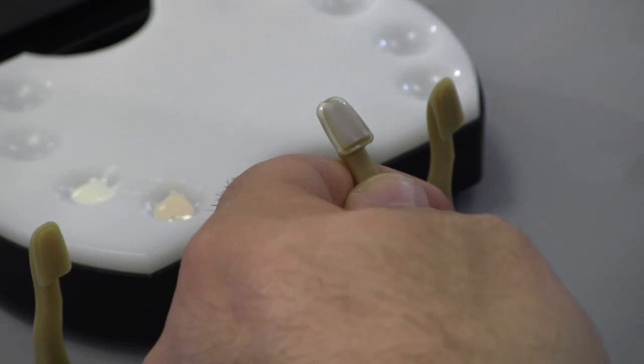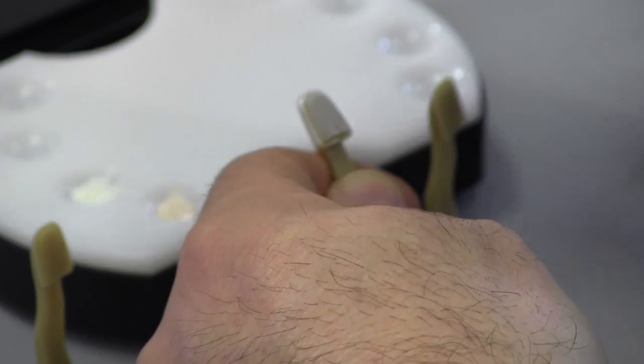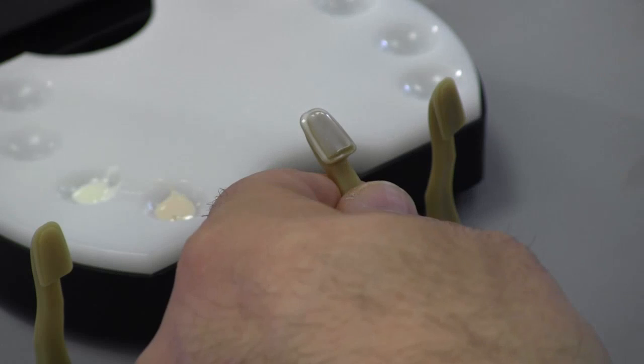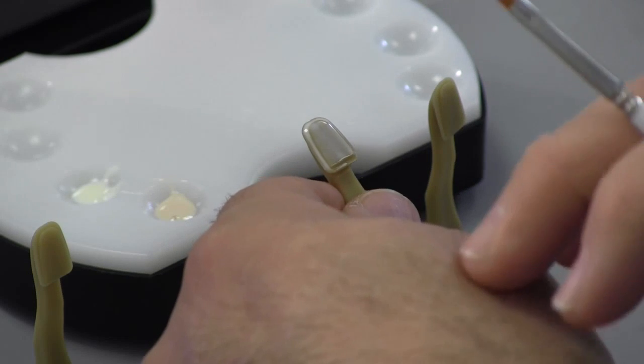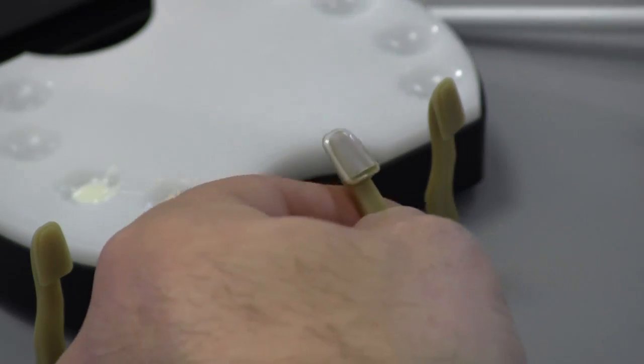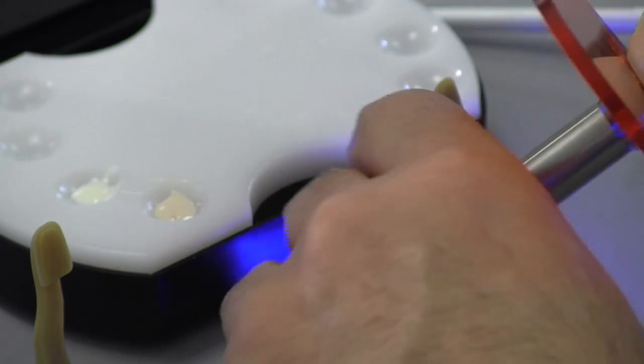To come back from this color is very difficult because once you put your composite over the top, it has a tendency to be either too bright, or white and brown can bring the value down of your restoration. So we're going to polymerize this for 10 seconds.